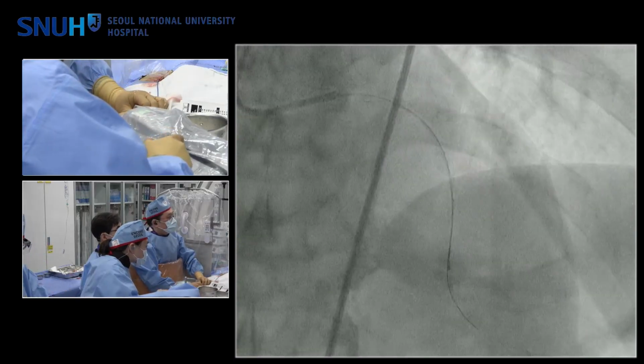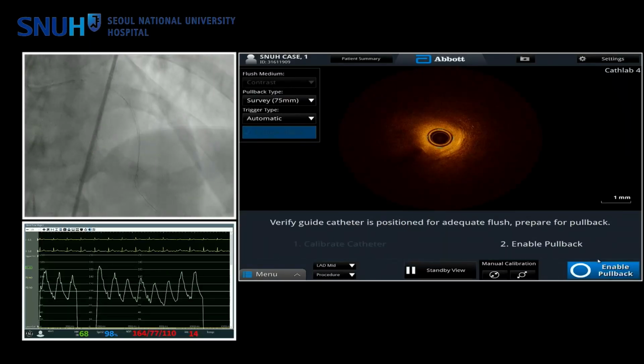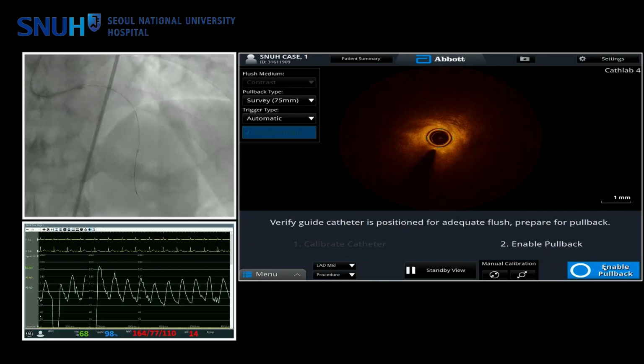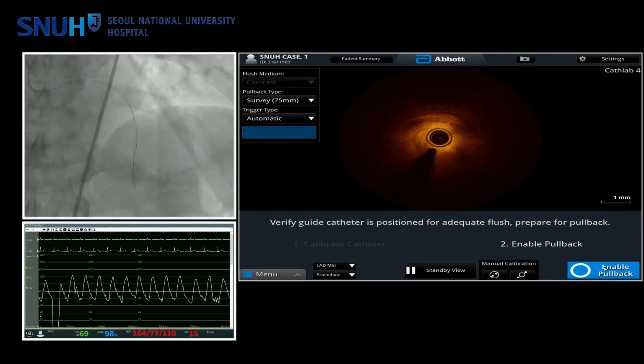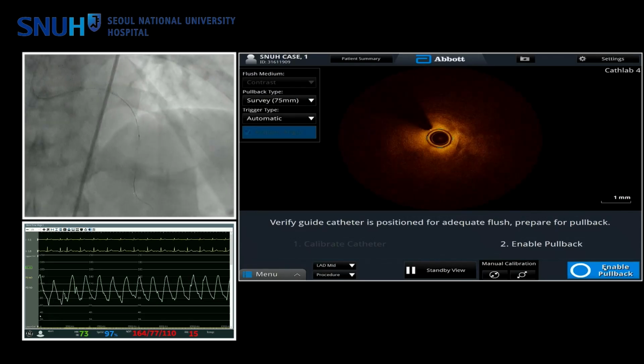So I'd like to ask for comments on this rationing of the shocks, with more shocks for calcium nodule. Would you focus your shock on specific spots, or do you just ration the whole segment with an even distribution of shocks? Right. We deliver a differential number of shocks depending on the different segment.